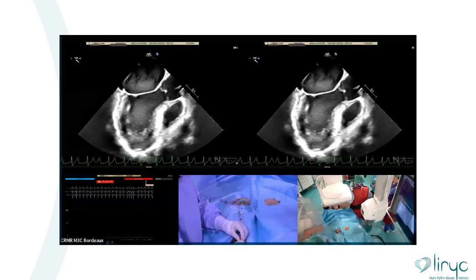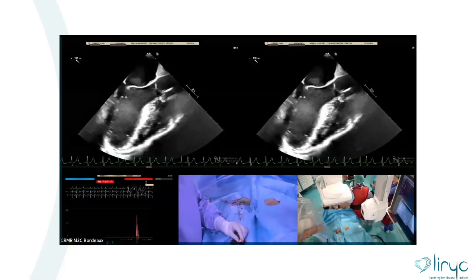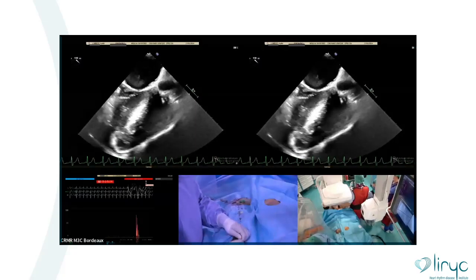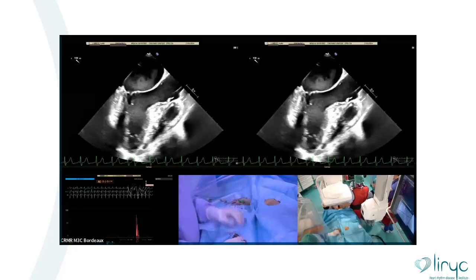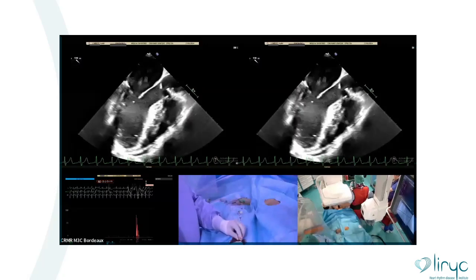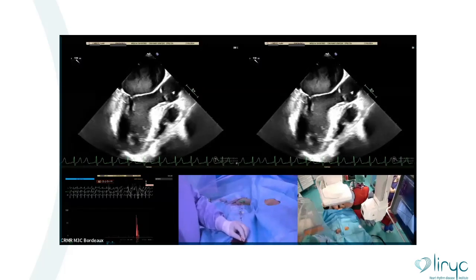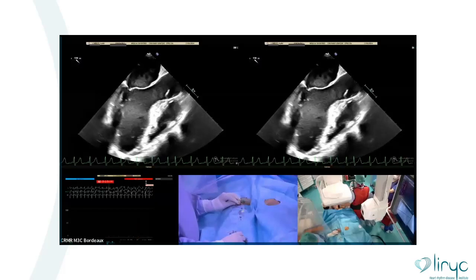Advance the wire. Where's the wire? Impression on my wire. You are back in the ascending aorta, guys. You lost again. Don't advance the wire. So as Zach just said, you could see on this view that the VSD is extremely close to the aorta.